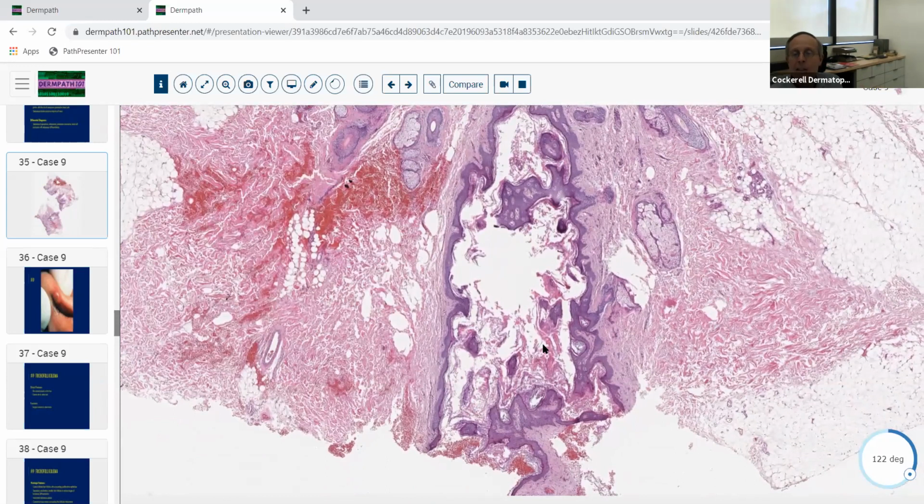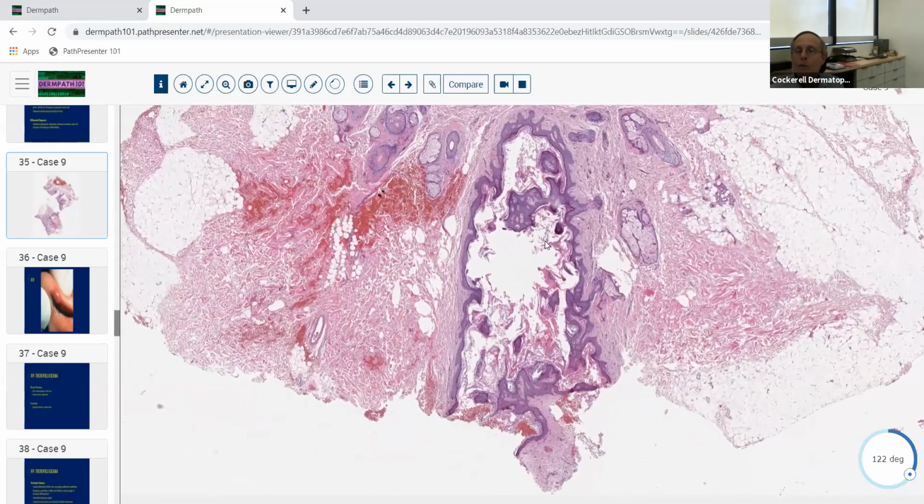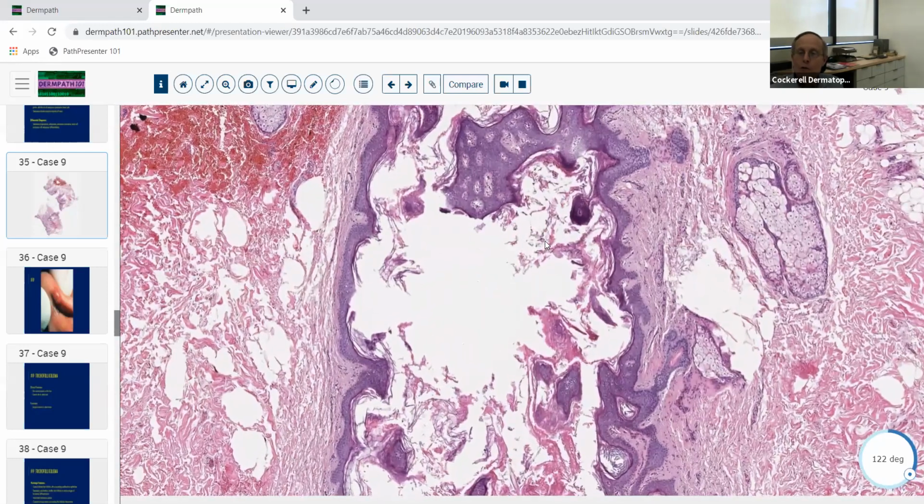So let's pretend that we had 50 of these instead of just 2. So what's the most likely diagnosis when you're looking at that? Trichofolliculoma. That's good. So you think of trichofolliculoma as like a cyst, and it's kind of like a little pinwheel, if you will, or a Ferris wheel. It's got the little tiny miniature follicles radiating off the central part of it. And then in the center of it, you'll see this little white tuft of hair, in these cases. So that's a trichofolliculoma.